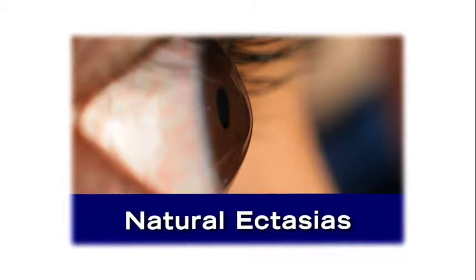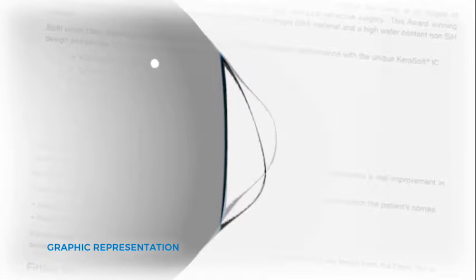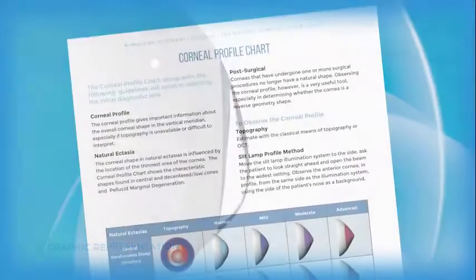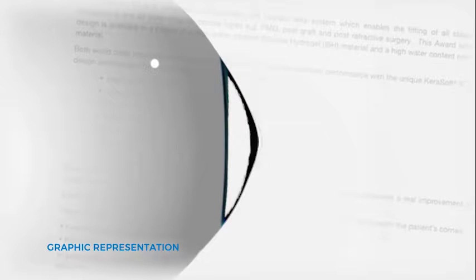Natural ectasias, which include keratoconus and pellucid marginal degeneration, can be categorised into four groups, based on the location of the thinnest area. These are keratoconus with a central cone with a steep or flat periphery, keratoconus with a decentered cone, keratoconus with a low cone, and pellucid marginal degeneration, which exhibits limbal thinning. These categories can then be further defined by the severity of the ectasia, which may be mild, moderate, or advanced.